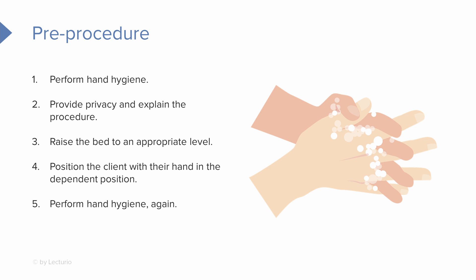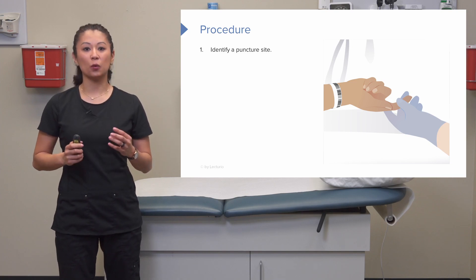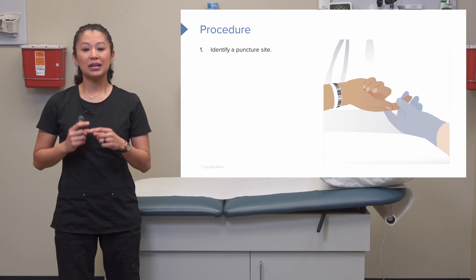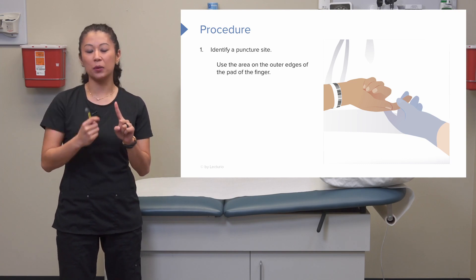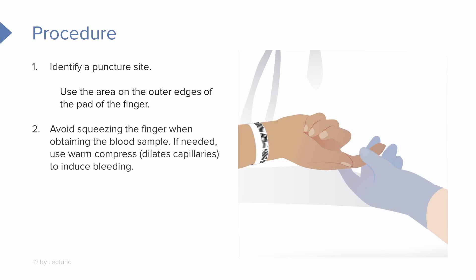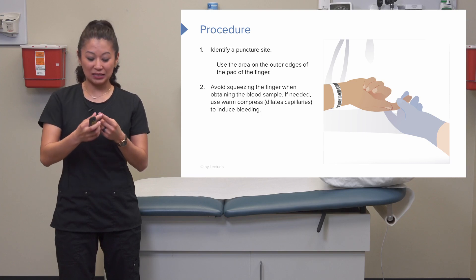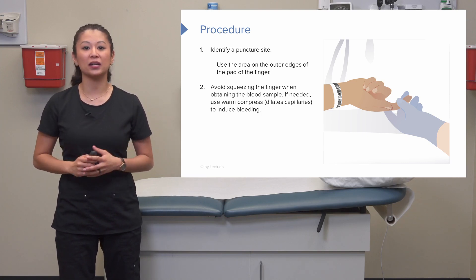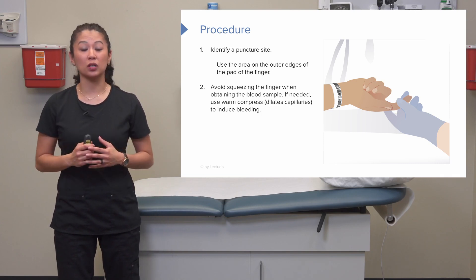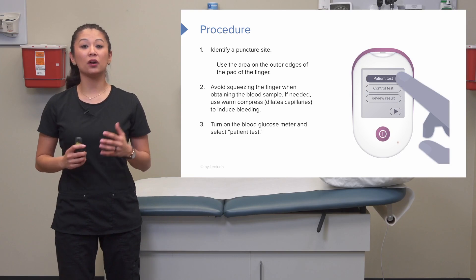Perform hand hygiene again and put on gloves. Now identify a puncture site — many times this will be the patient's finger. We typically avoid the middle pad of the finger and go around the outer edges. Occasionally you may need to apply a warm washcloth or compress to dilate the capillaries for a good result. Avoid squeezing the finger tightly, as this can skew the results.